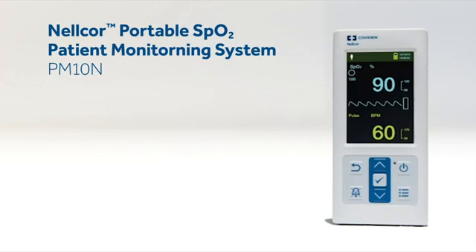The Nellcor portable SpO2 patient monitoring system is part of the total solution for respiratory function monitoring. The PM10N provides clinicians with the critical features in a handheld monitor at an economical price, for accurate, reliable SpO2 measurements.